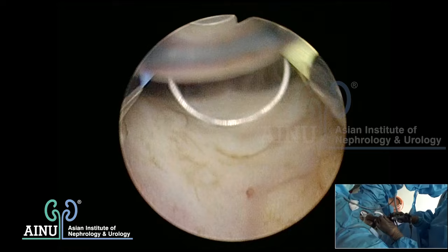There's a lot of tissue - that's capsular there. I am going to resect that tissue also. I started at 1 or 12 o'clock position, resecting deep to expose the 11 o'clock bleeder supplying that area. We coagulate that point, then start moving from the capsular area towards the center and resect the gland. The upper half is over. The same bleeder may open again if the capsule is not completely reached at that point. I go back to the capsule and resect from the medial aspect, taking out the gland hanging in the center of the urethra.